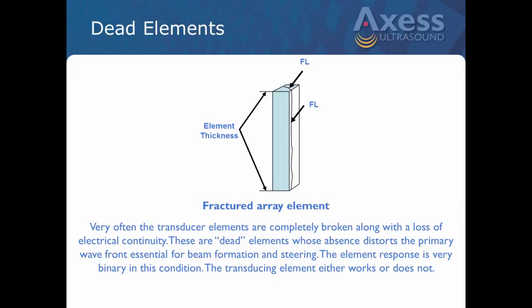Okay, I got a question here that's come through from Lucio. Can crystal-based transducers produce 3D images, or only the capacitive, the CMUT? No. That's a great question. Today, most of your 3D, 4D probes are the composite array type of transducers. CMUT can do 3D, 4D.